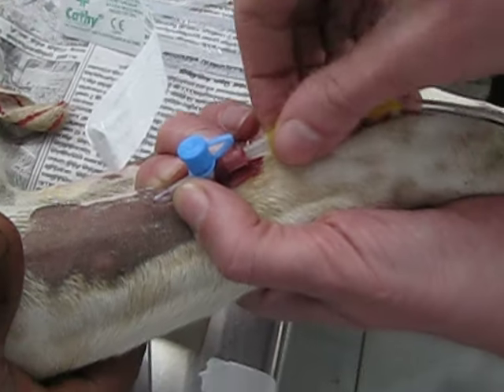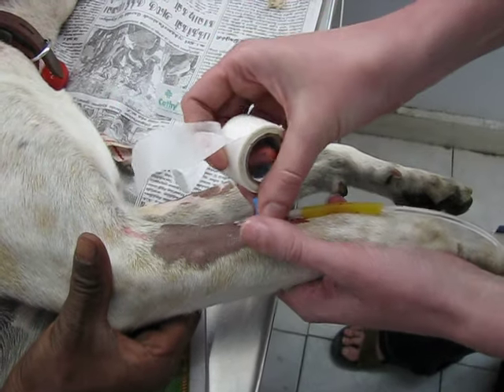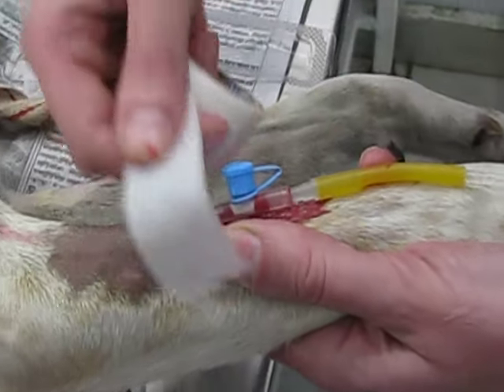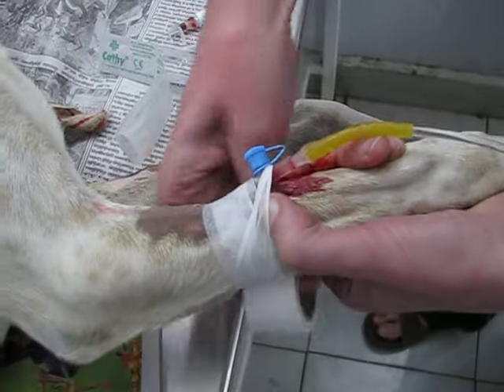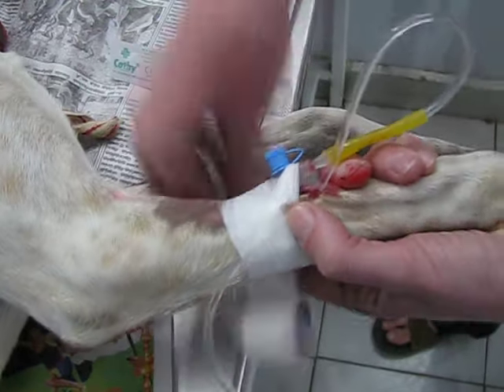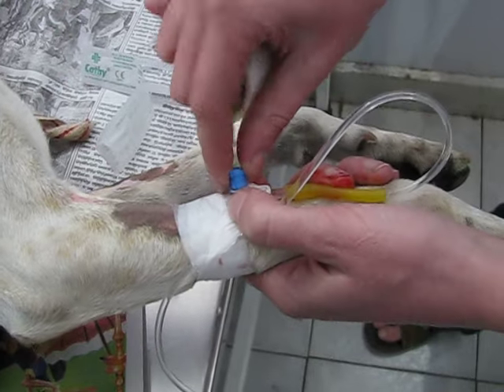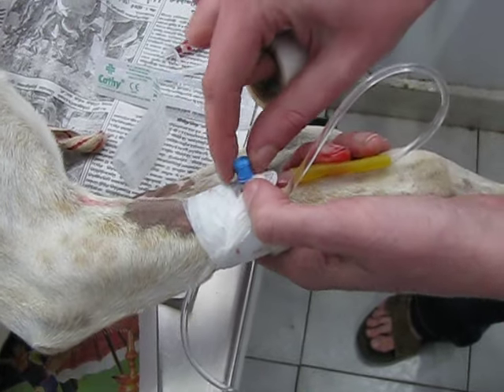We have the drip immediately there, and tape ready. We tape it, making sure the catheter is really fully inside. We tape this very strongly, and I always do a little loop to help keep it in place. We make sure the cork is left accessible so that we haven't taped across it and can still open it.